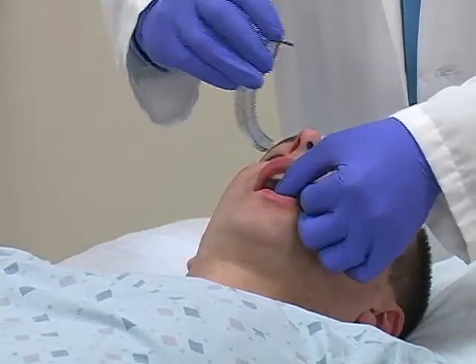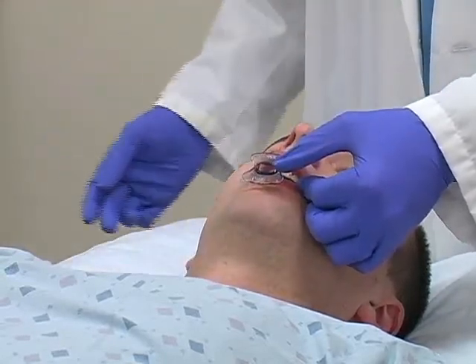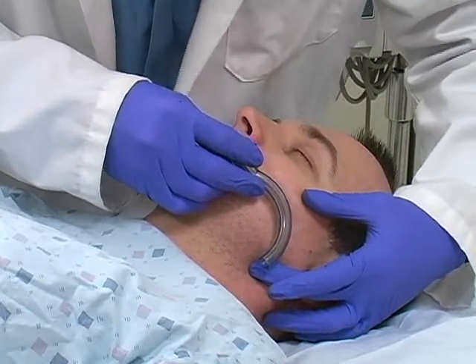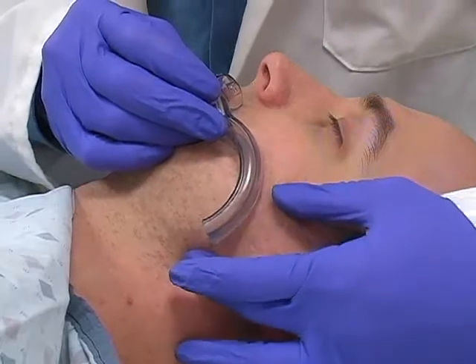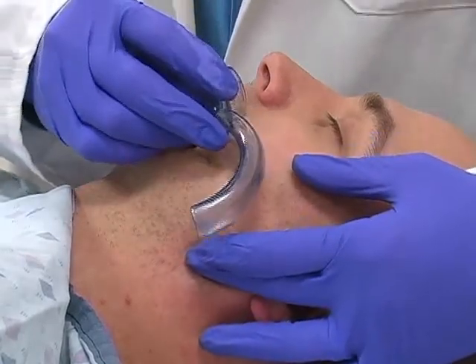Oropharyngeal airways are used to maintain airway patency and generally should be used whenever bag mask ventilation is required. First, determine the appropriate size oropharyngeal airway for the patient. When held against the side of the face, a correctly sized airway will extend from the lips to the angle of the mandible. This airway is too small, since it does not fully reach the mandible and should be replaced with a larger device, as shown here.